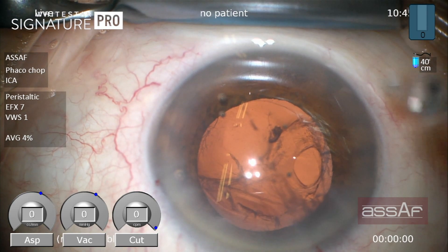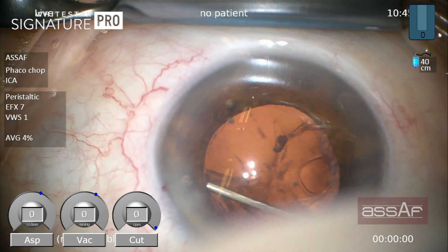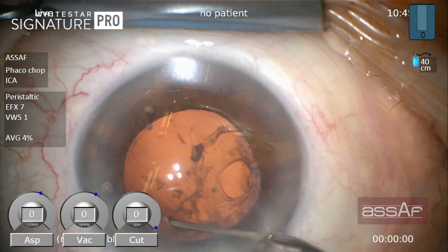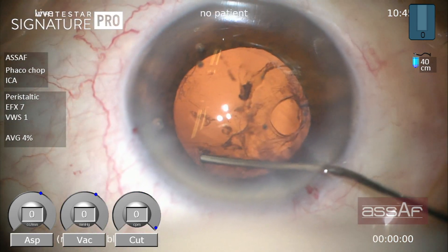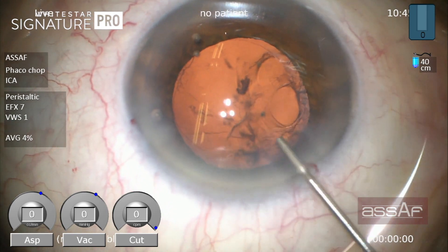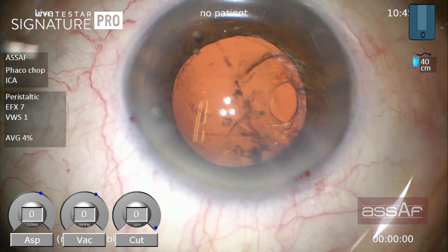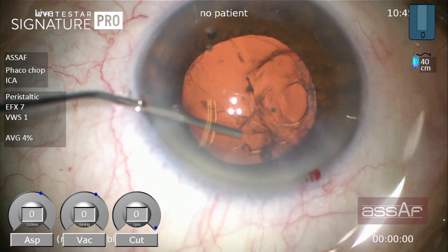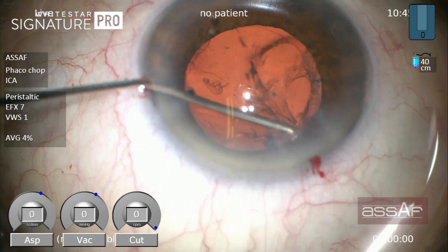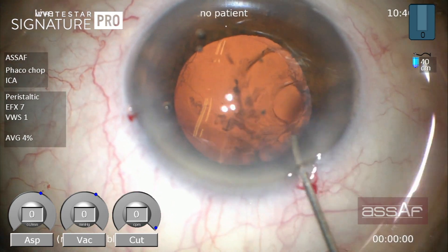Here I decided to move away from the area of the break because I had a suspicion that some vitreous had already prolapsed into the anterior chamber. I decided not to invite more vitreous or stress the vitreous base, as this might eventually cause breaks in the periphery of the retina. As you can see, aspiration of the sub-incisional cortical fibers can be quite difficult through the paracentesis.